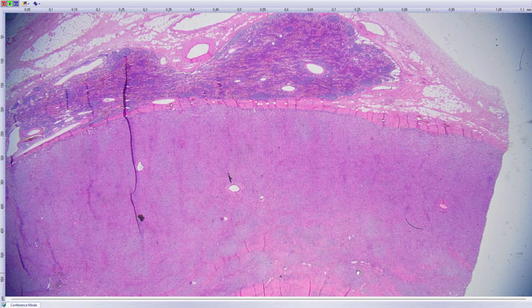It's a very new thing. And this fibrosarcoma case had a fusion also. The case I showed you is VGLL3 fusion. It's one of the typical fusion partners. I don't remember. So the thing is, always when you have a mesenchymal tumor of the tongue, then it might be this tumor, and if you find out the, what is the name of the translocation?